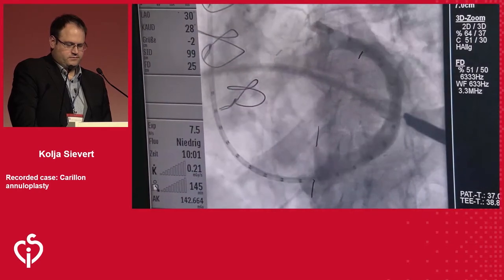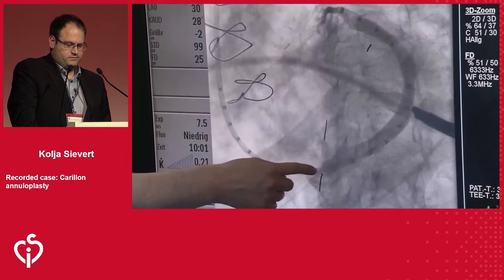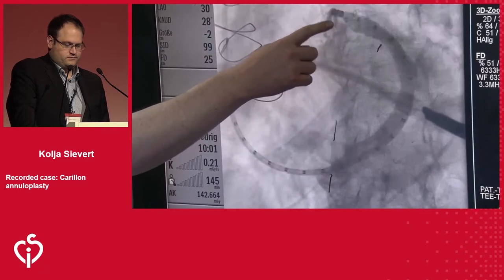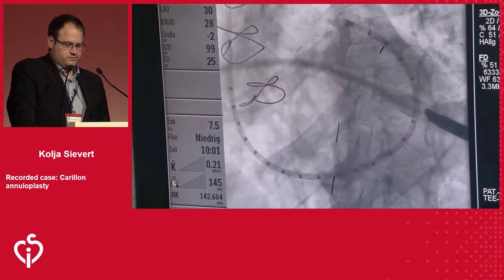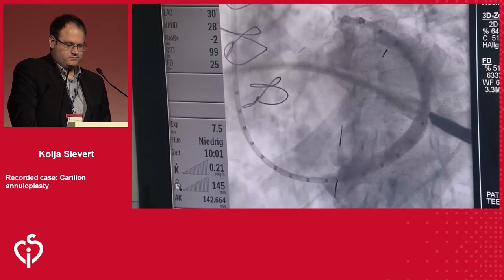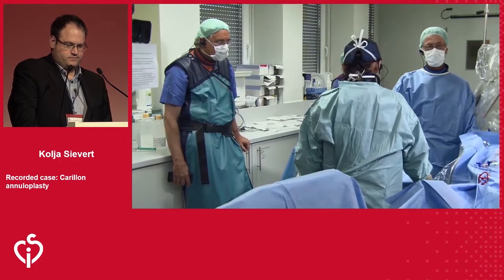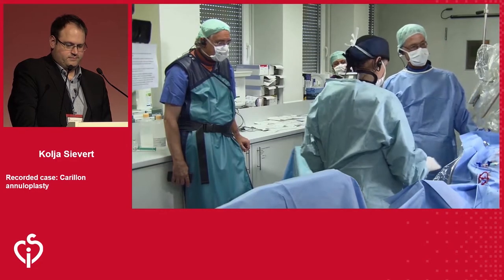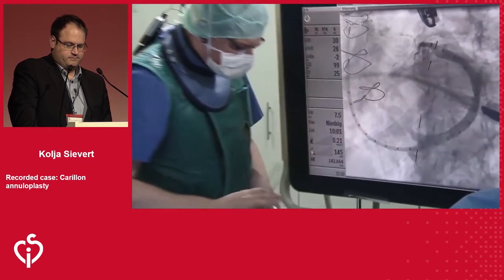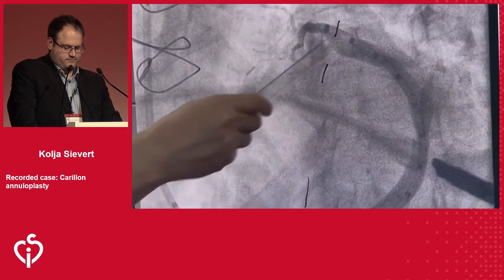The other thing that's really nice to see here is that we have about 11 centimeters from the ostium all the way up to the junction between the great cardiac vein and the anterior interventricular vein. So using a 6-centimeter device will allow us to pull roughly 5 centimeters of tension. All right, so I think we have some measurements here. The average diameter of this distal segment here is just under 7 millimeters. I'm getting about 6.8 right here.